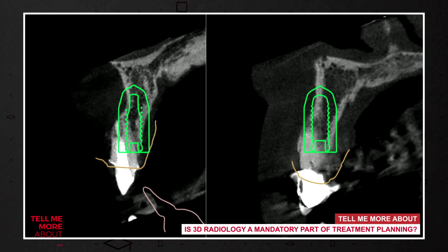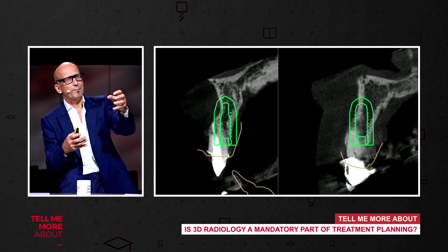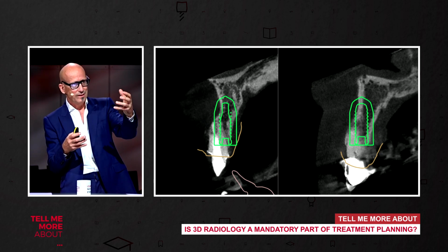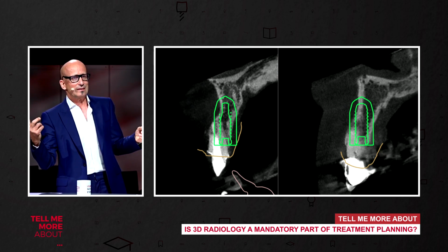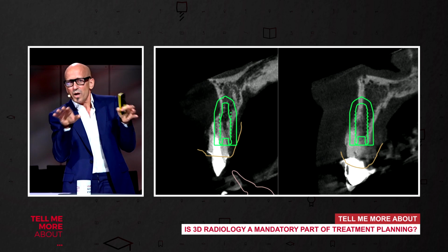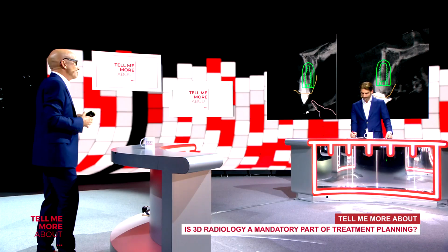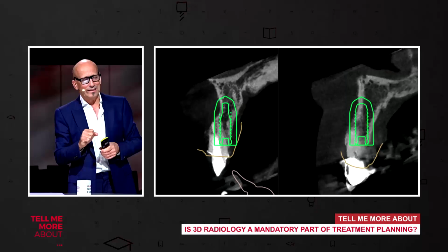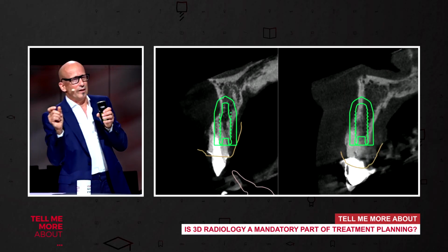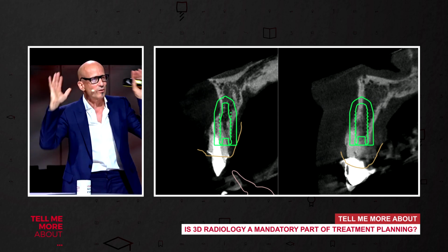Now think, you have to place, as a clinician, your implant in this position. This is the right position, what we analyze three-dimensionally. But now you have to do this, taking out the tooth and placing your implant into this hole, without knowing where the bone really is. And we all know placing an implant in the aesthetic zone is so demanding. We have to place it almost to 1/10 of a millimeter precision. And we are not allowed to be too close to the neighboring teeth. We are not allowed to be too deep and not too high, and all this detail.